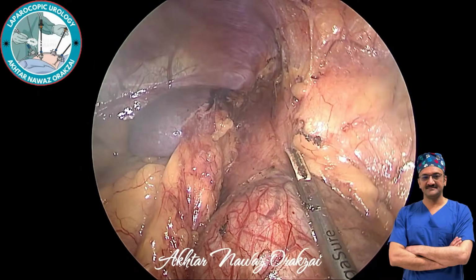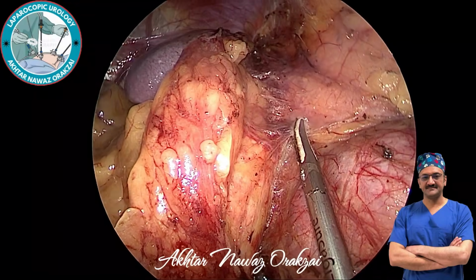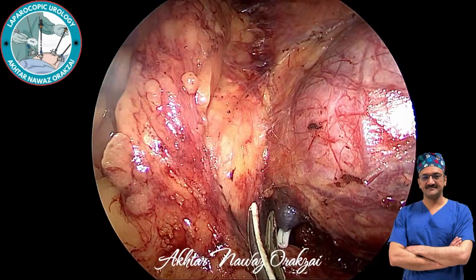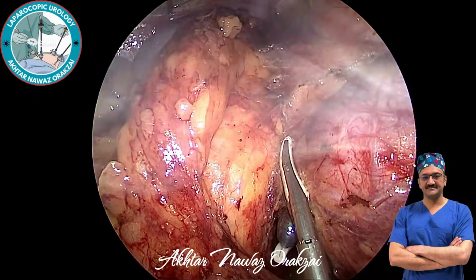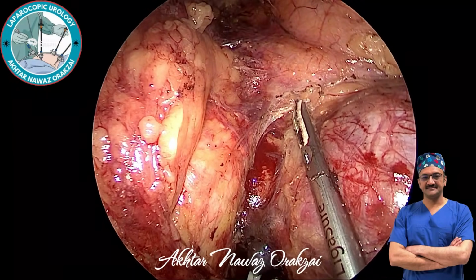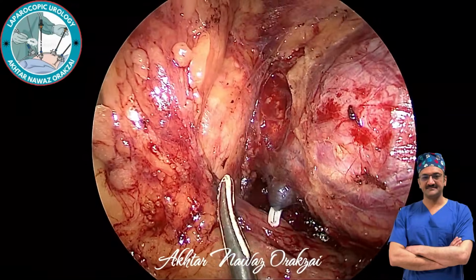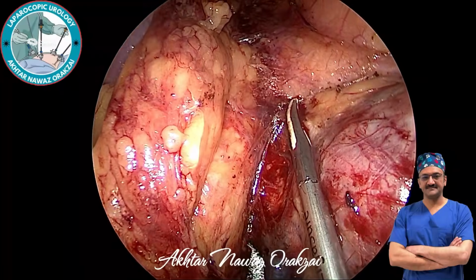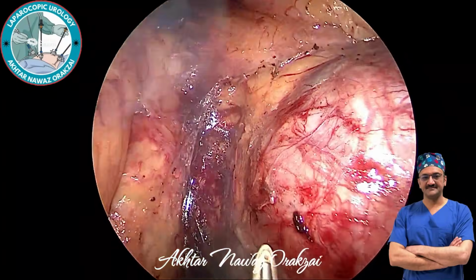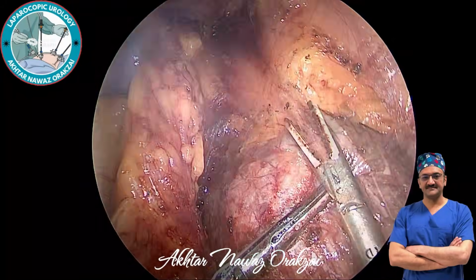So there are three arteries which are coming to the left-sided adrenal gland: the superior, the middle, and the inferior adrenal artery. The superior adrenal artery is a branch of inferior phrenic artery. Here you can see that branch. And the middle adrenal artery is a branch which is coming directly from the aorta, and the inferior one is from the renal artery.